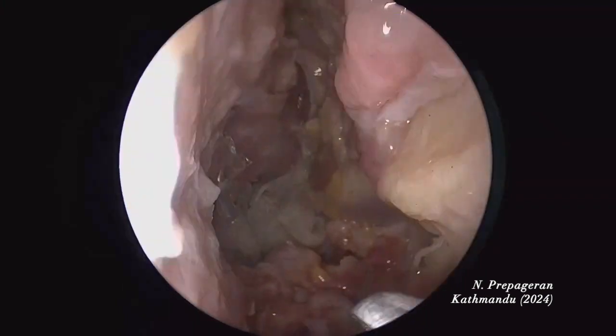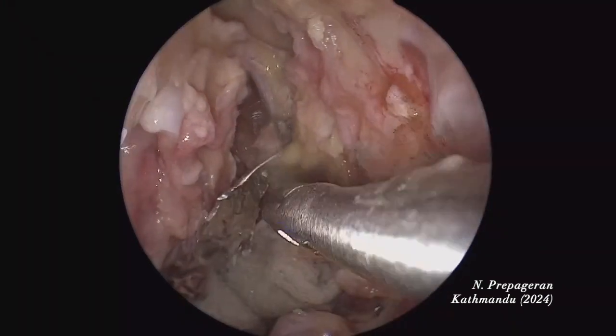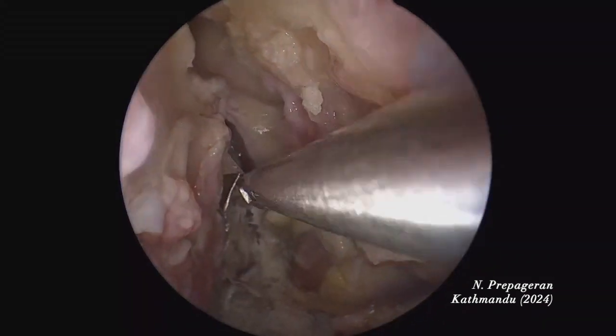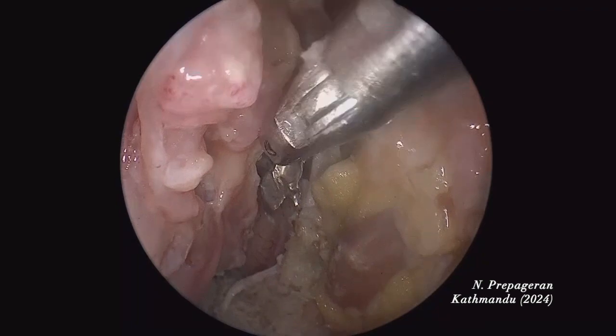You do the same thing on the opposite side. Meet both sides — go around here and go around here. Here, that's crista galli. So you need to cut the dura here and you'll find crista galli inside. This is olfactory nerve — crista galli up there. If you cut this, the whole thing drops down. That's how you do a transcribriform. For reconstruction of a transcribriform, you put a fascia lata across like this, cover the entire defect, and then apply tissue glue.